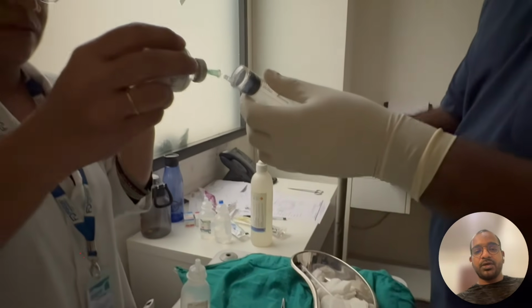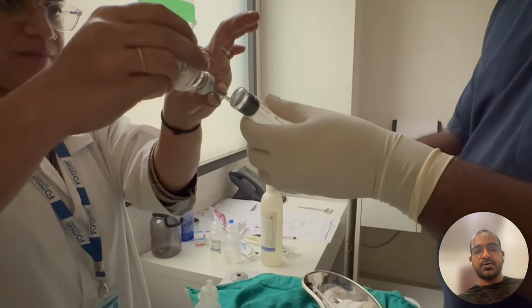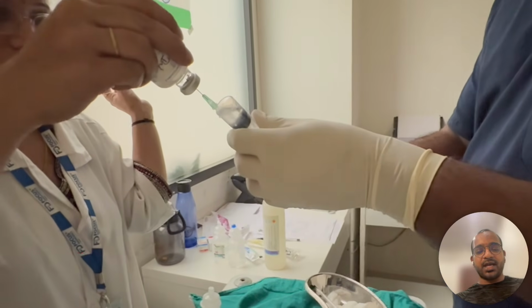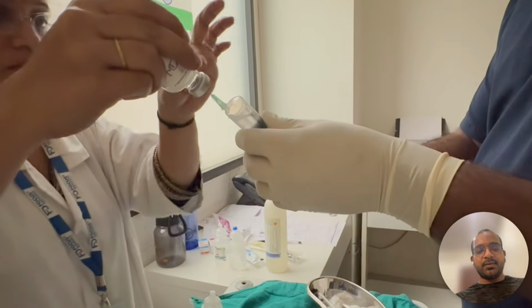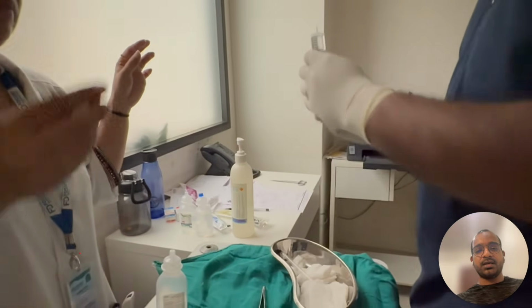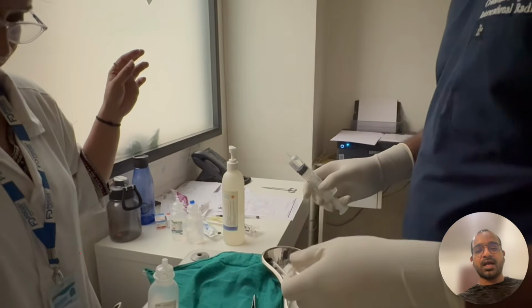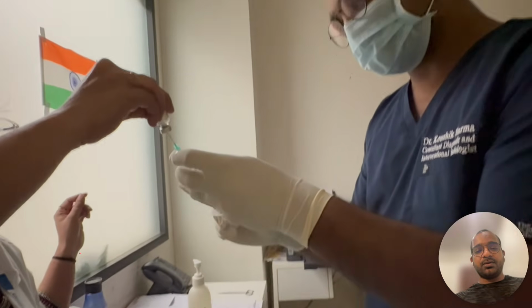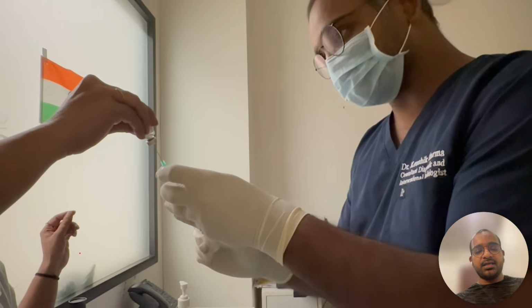So, what I am going to do in this case is a hydrodissection of the lateral femoral cutaneous nerve of the thigh. What I'm going to use for this is a hypertonic medium, so I am taking 25D.